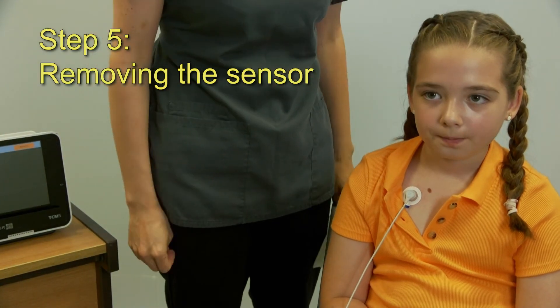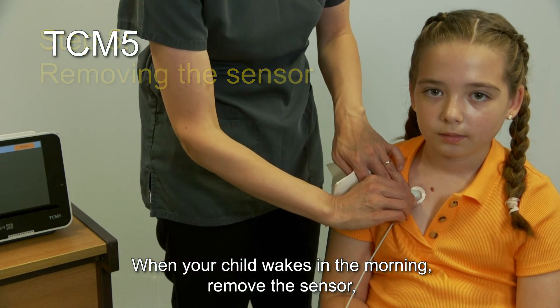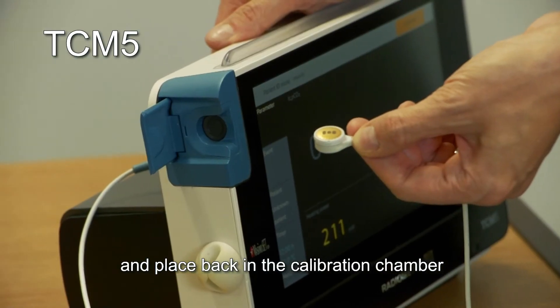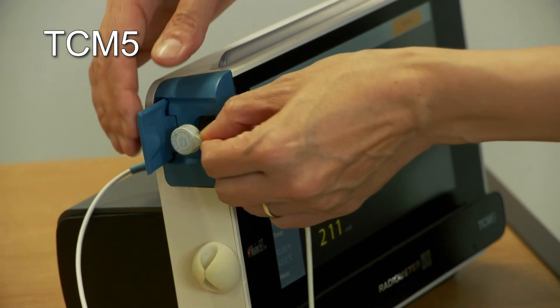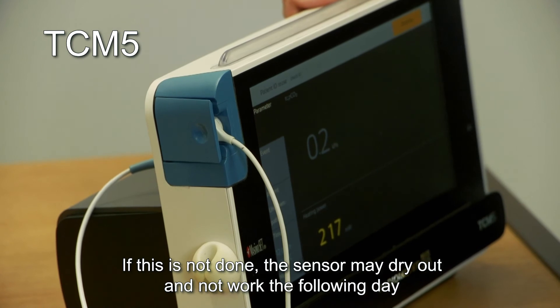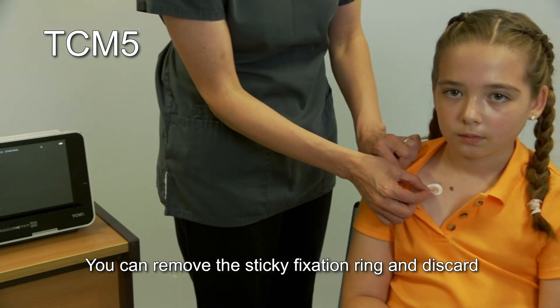Step 5: Removing the sensor. When your child wakes in the morning, remove the sensor, wipe with a paper towel or tissue, and place it back in the calibration chamber with the gold side facing inwards. If this is not done, the sensor may dry out and not work the following day. You can remove the sticky fixation ring and discard.